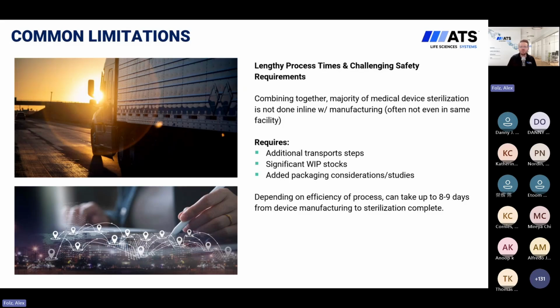What is the impact next quarter, next year, right? And some of that does come with common limitations of the modalities we talked about, and those are typically the lengthy process times and challenging safety requirements. So when I combine those two aspects together, the majority of medical device sterilization is not done in line and is in fact not even typically done in the same facility, right? A lot of sterilization is outsourced to an ethylene oxide facility, a gamma radiation facility, so on and so forth.